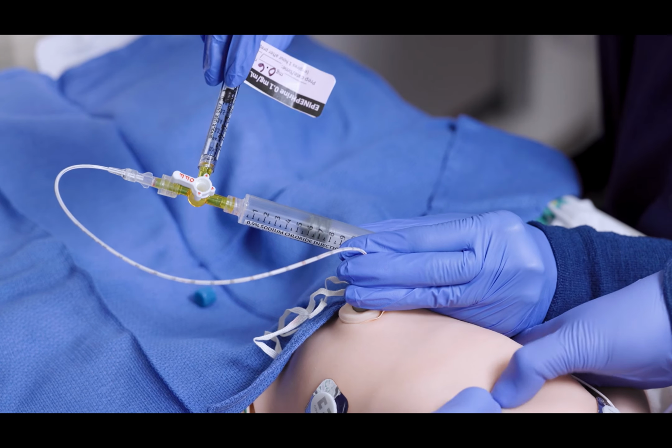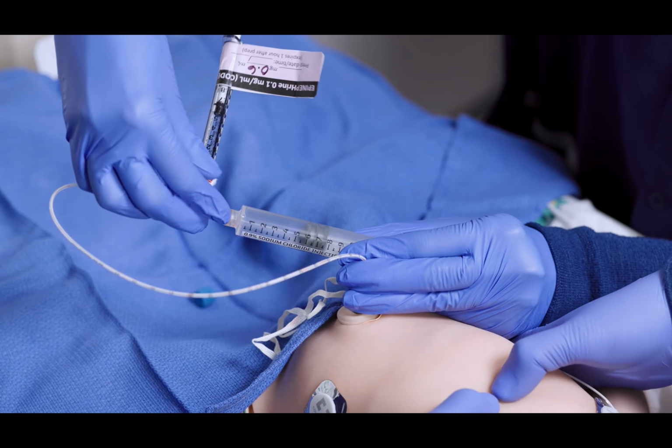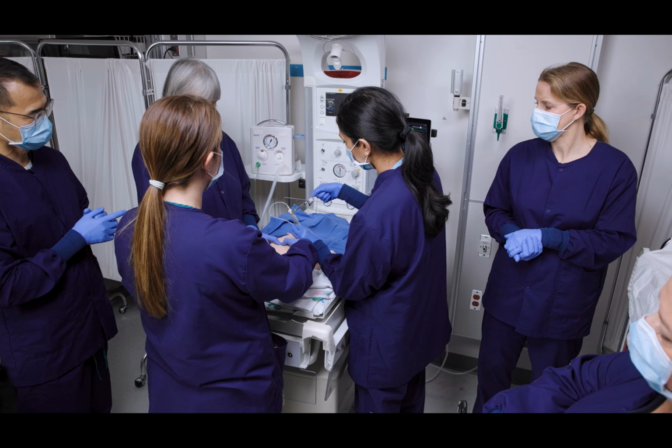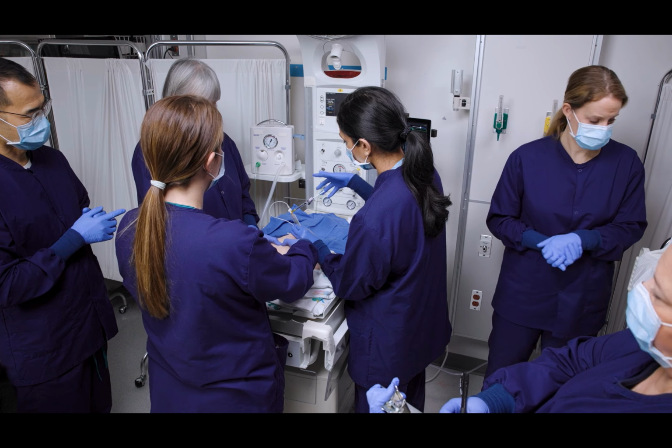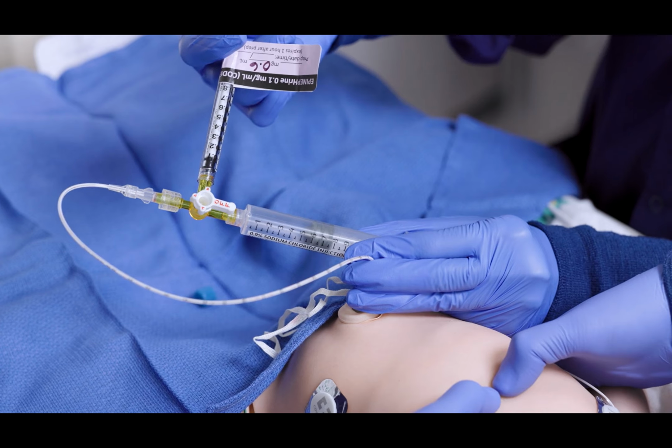Ensure that the catheter is being held in place to avoid dislodgement. Attach the syringe to the stopcock. Open the stopcock to the catheter and syringe, aspirate slightly to remove potential air bubbles, and administer the epinephrine rapidly.